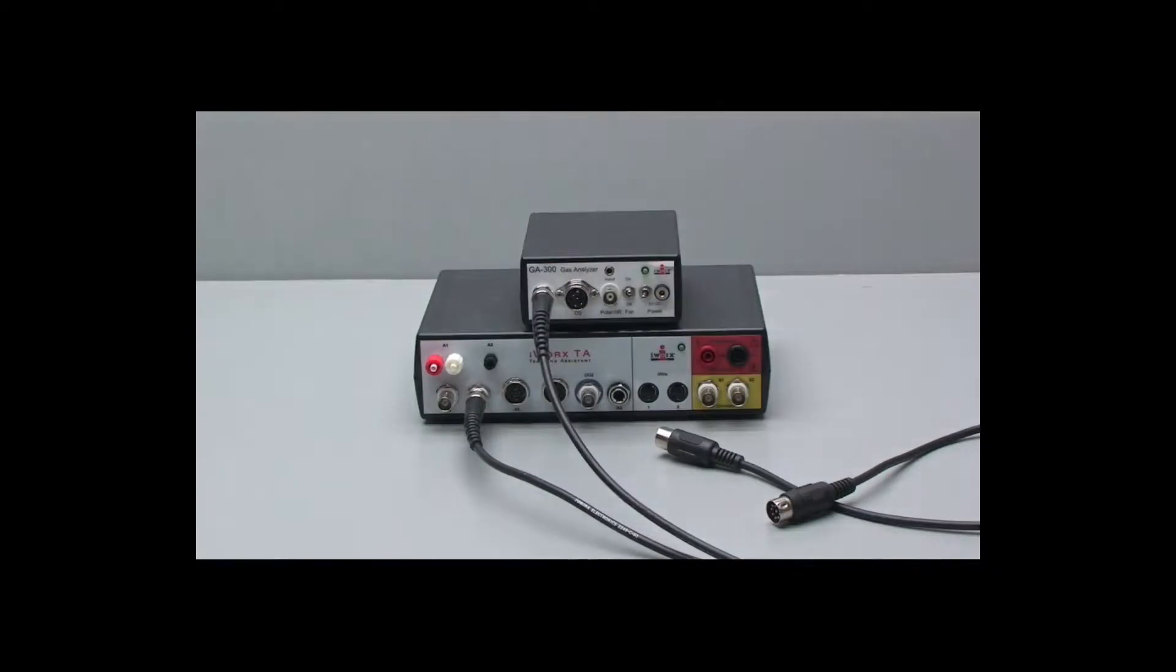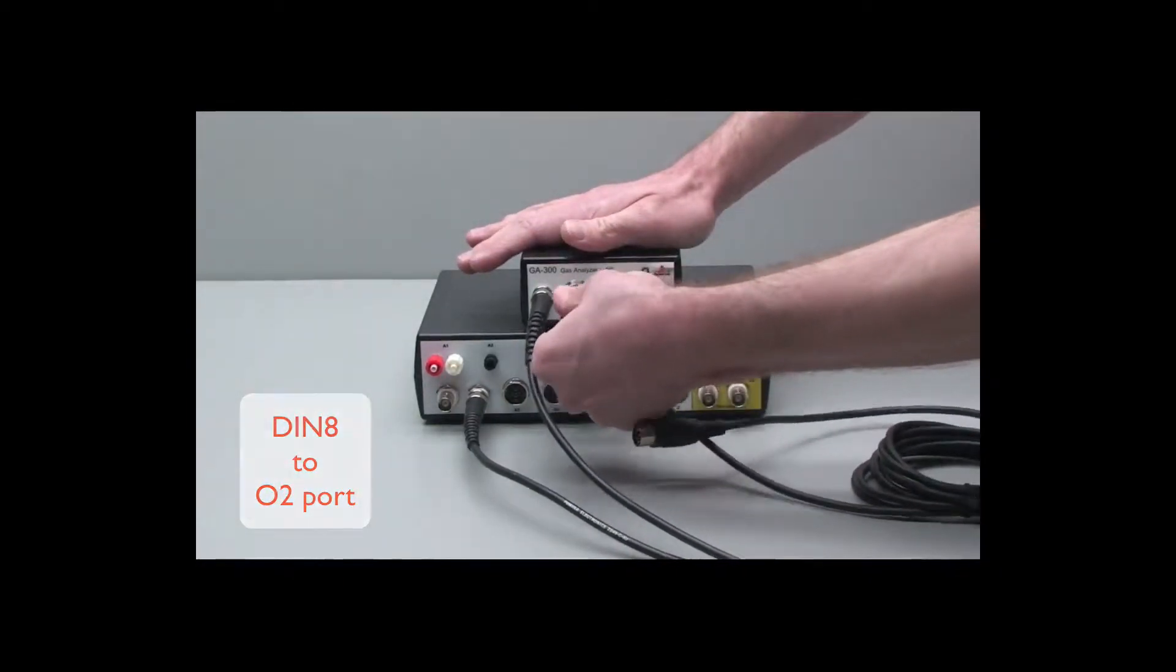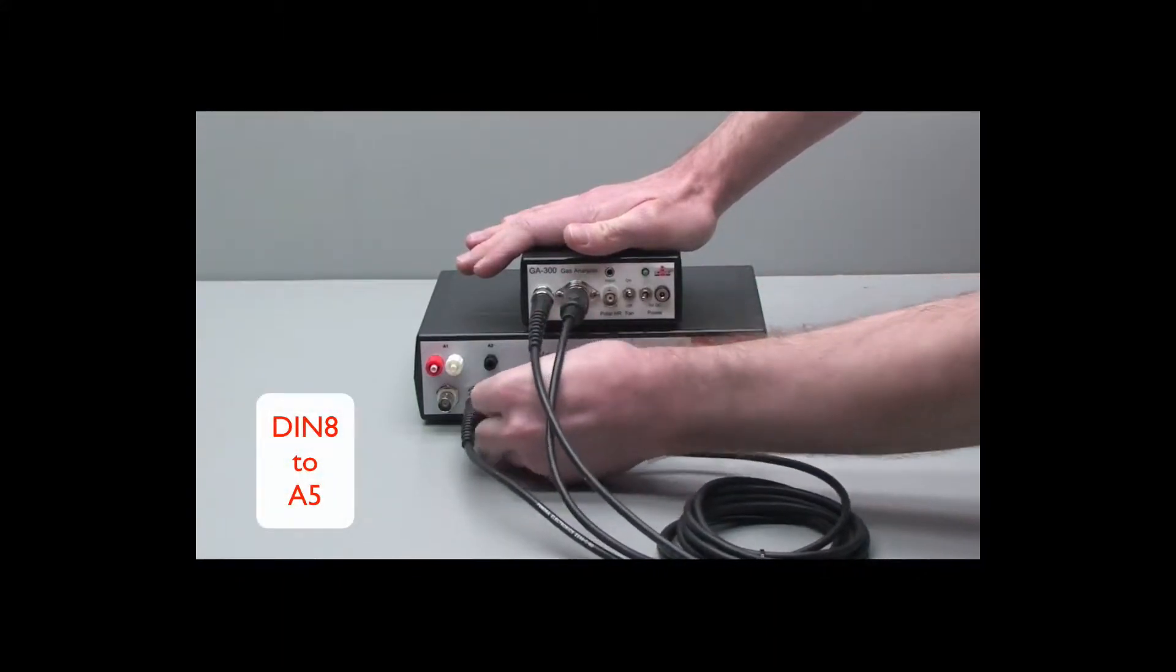Take the DIN8 to DIN8 connector, one end goes to the O2 port, and the other end to channel A5 on the front of the TA.